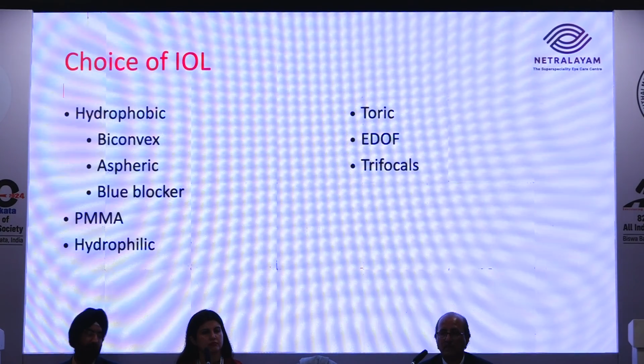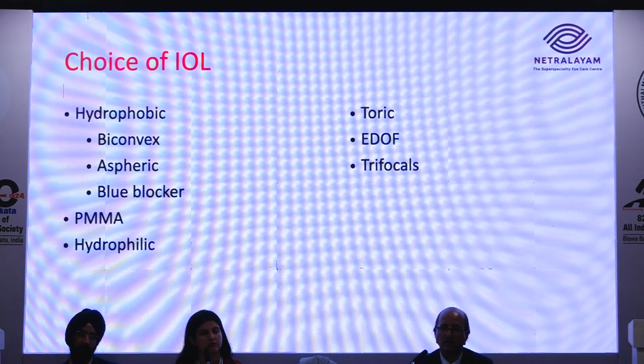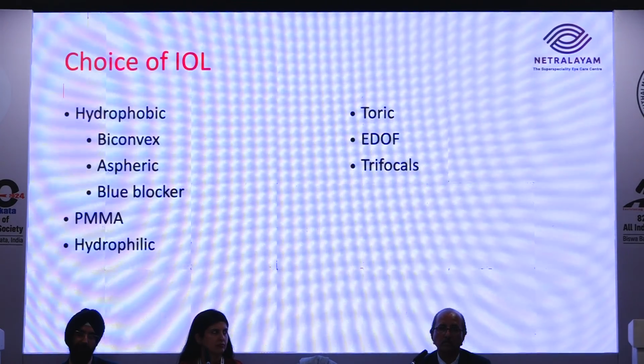Again, just the last slide, about the choice of the IOL when we are operating in children, whether it is hydrophobic or a PMMA or a hydrophilic. Hydrophilic is a big no in children. We don't use hydrophilic lenses. Hydrophobic biconvex is definitely a universal choice, but now with more experience, we are using aspheric and blue blocker lenses also. And toric in older children, especially if they have a higher cylinder, then it is always advisable to give toric lenses.